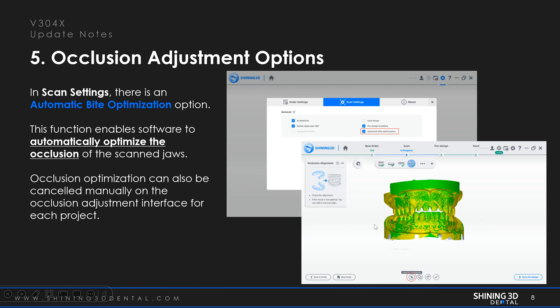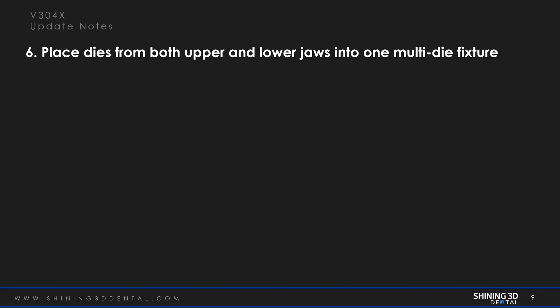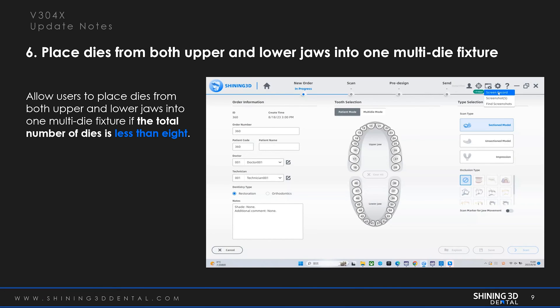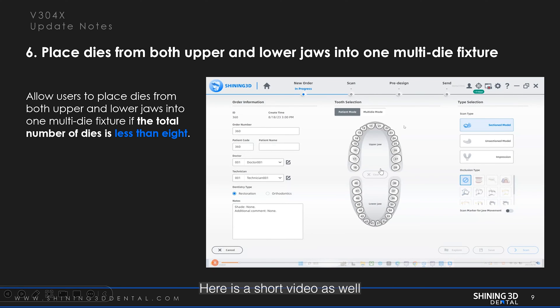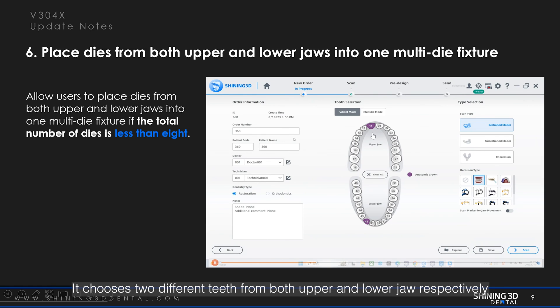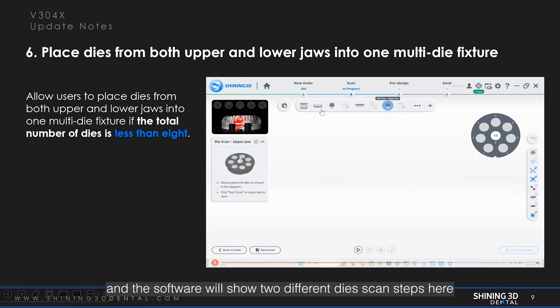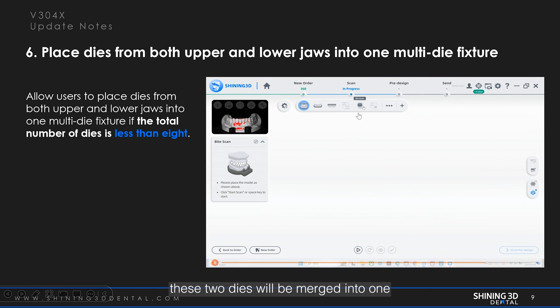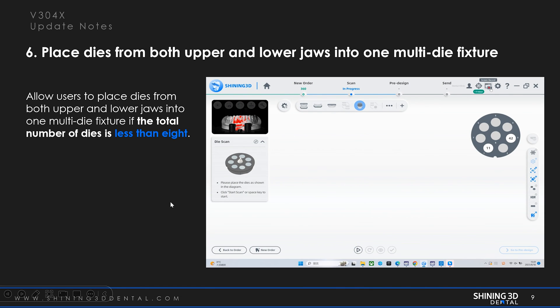As you can see here. The sixth upgrade feature is placing dies from both upper and lower arches into one multi-die fixture. It allows users to place dies from both upper and lower arches into one multi-die fixture if the total number of dies is less than eight. Here is a short video as well. It shows two different teeth chosen from both upper and lower arches respectively, and the software will show two different die scan steps. After enabling this function, these two dies will be merged into one, and we can place dies from both upper and lower arches into one multi-die fixture. It is time saving.